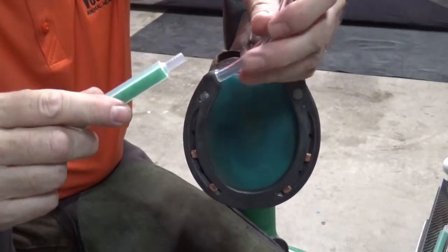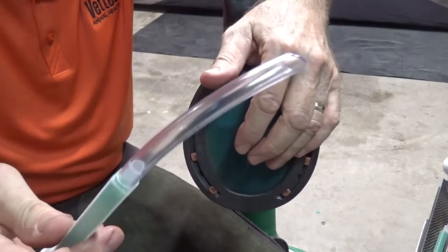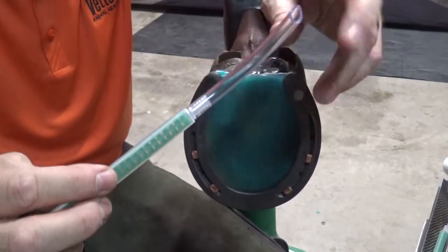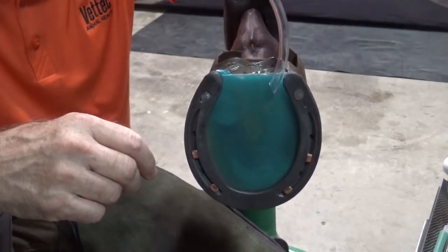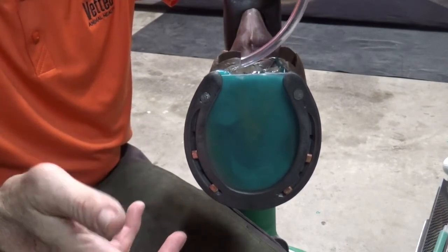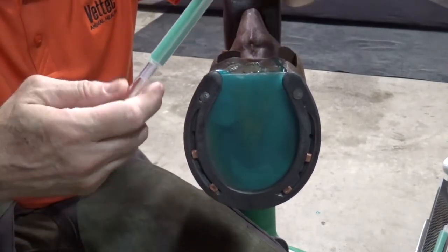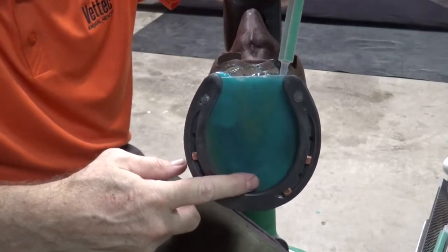The other option is the use of quarter inch vinyl tubing. Quarter inch ID fits very snugly over this mixing tip. Same thing — you insert it at the heels under the pad and back it out as you fill. Those are a couple of options if you're really concerned about the material setting before it reaches the toe.